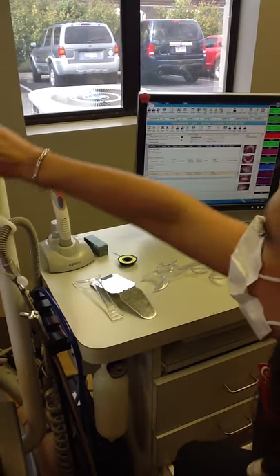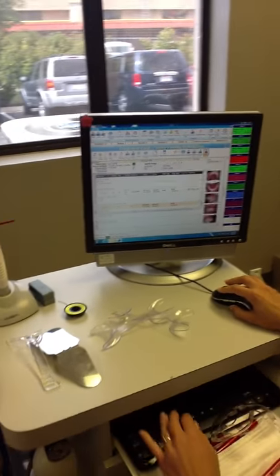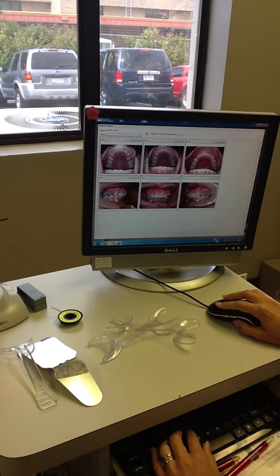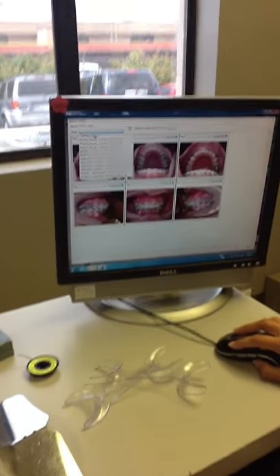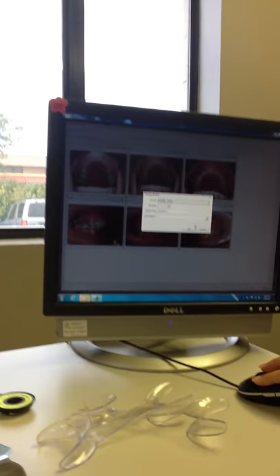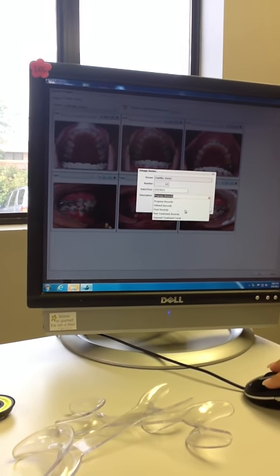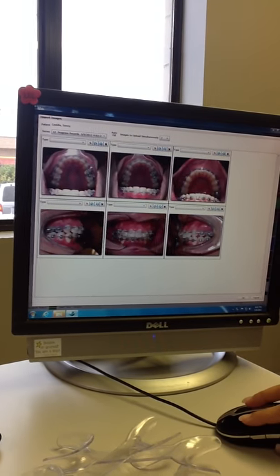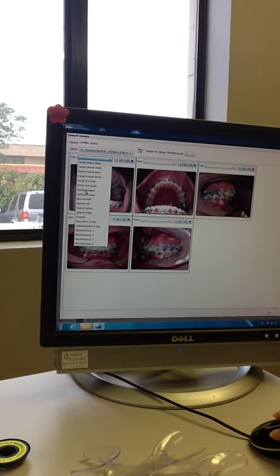You can either sit your patient up or have them remain laying down while you load the photos. Watch carefully as Lacey crops the photos and goes through editing the ones she does not like.